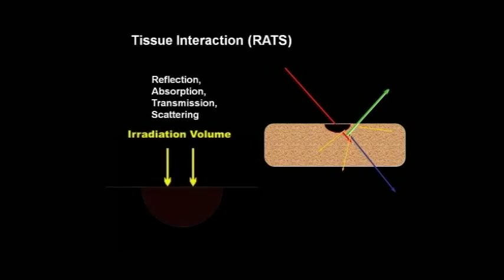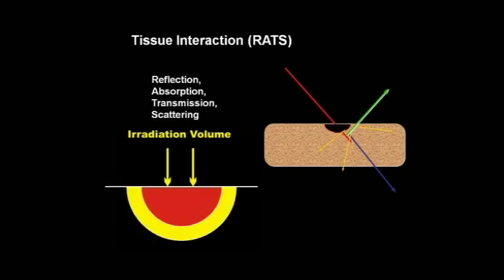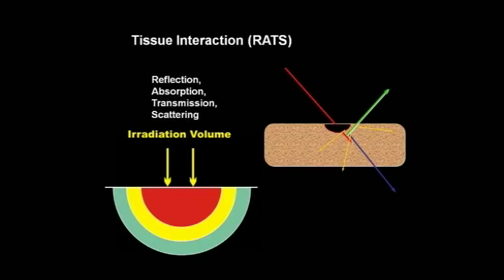When the laser beam hits a tissue, there is a localized area of cutting. When the diode cuts, or when the hard tissue laser cuts, there is this initial zone of cutting, and deeper underneath is a zone of coagulation, and finally a zone of edema. Ideally, we'd like to have the zone of edema to be very small. And so the less the depth of penetration of the laser beam, the less the lateral thermal damage, the better. As mentioned, the beam as it interacts can be reflected, it can be scattered, it can be absorbed.